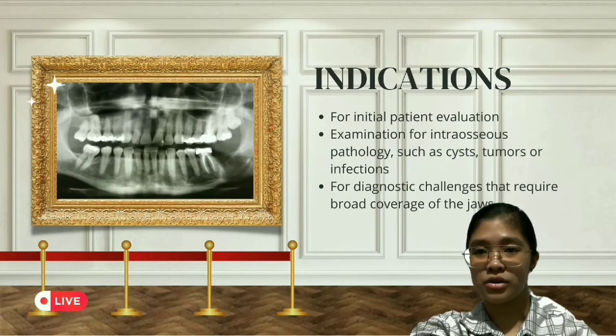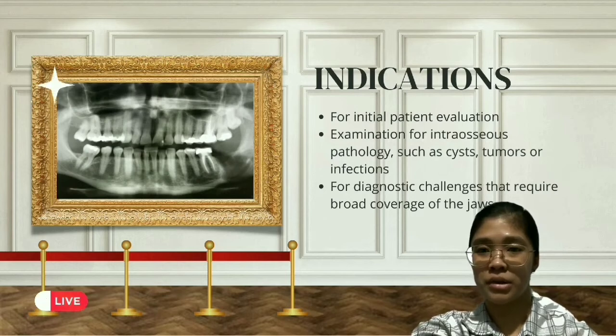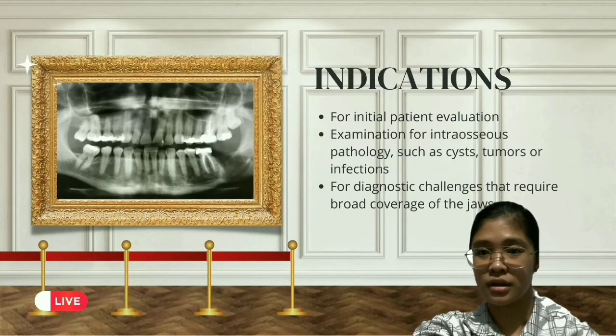Examination for intraosseous pathology or the evaluation of developmental anomalies such as cysts, tumors, or infections. And for the diagnostic challenges that require broad coverage of the jaws or for extensive diseases or lesions which cannot be seen in the intraoral radiographs.